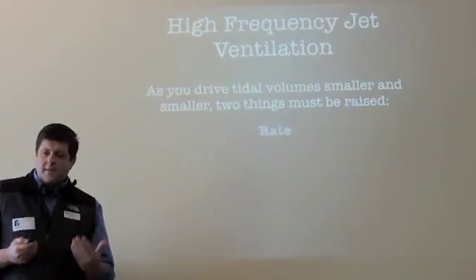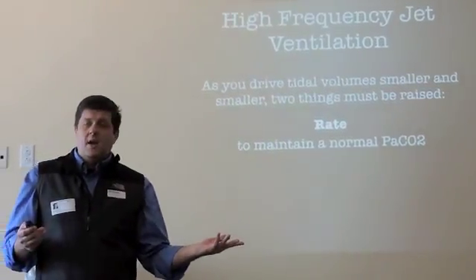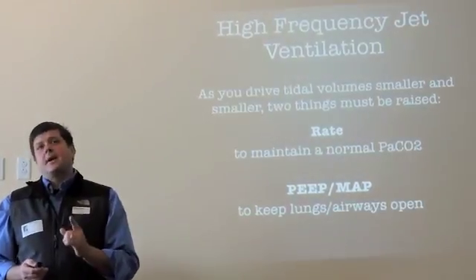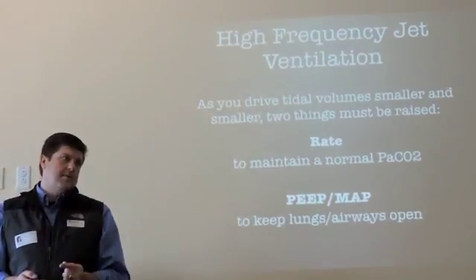As we drive tidal volume smaller and smaller with high frequency ventilation, two things must be raised. One, obviously, is the rate to help maintain our minute ventilation. But the other thing that you must increase is your PEEP and mean airway pressure. That's because you have to keep airways resistance to a minimum in order for high frequency to be effective.